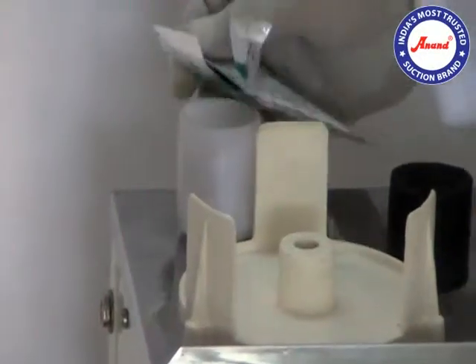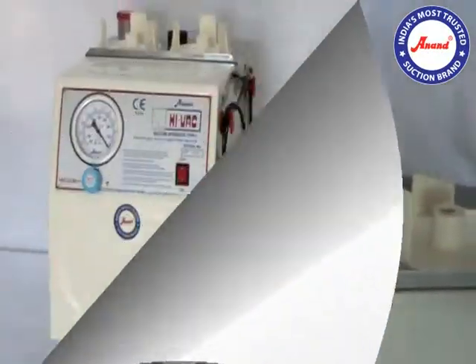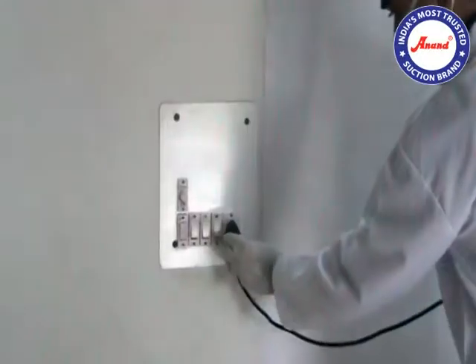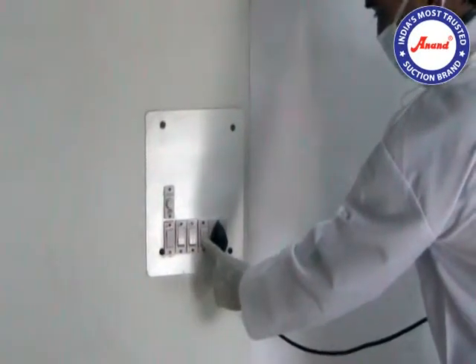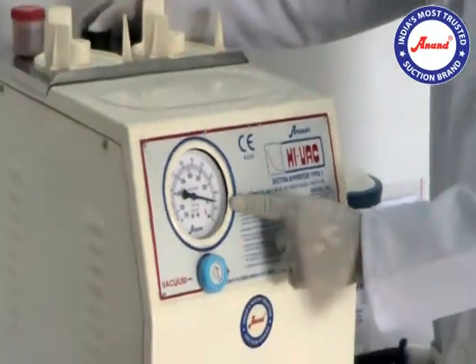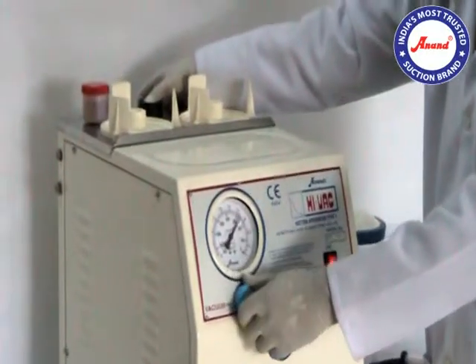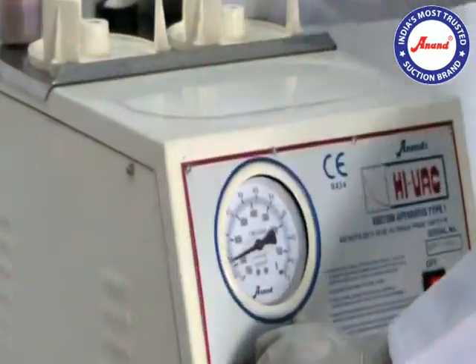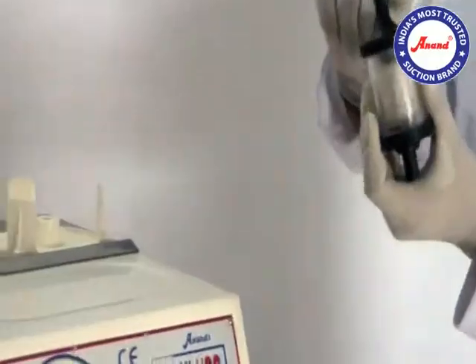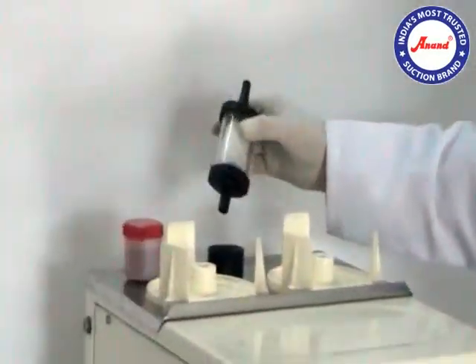Pour lubrication oil in the container. Plug the unit into the mains. Ensure that the vacuum control knob or release valve is fully tightened clockwise. Ensure that the thick end of the filter is inserted in the filter holder.